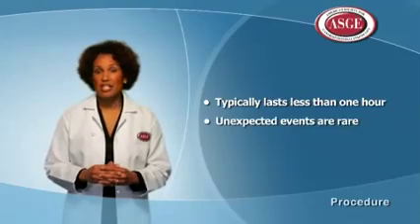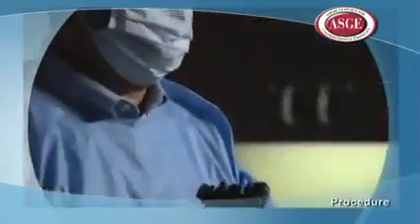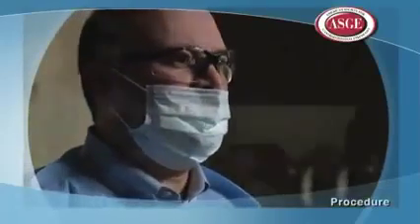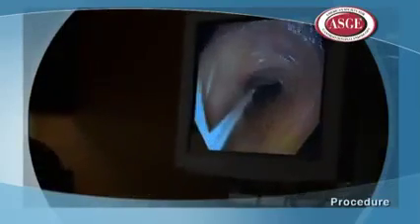Unexpected events or complications are rare, but they may occur. Complications of colonoscopy may include missing a lesion, making a tear in the lining of the colon, which is called a perforation, bleeding, or having a bad reaction to the medication used for sedation.